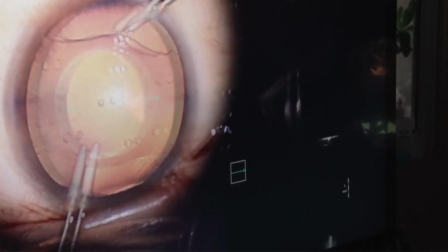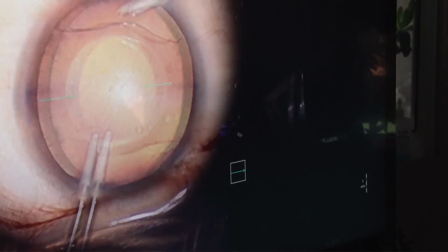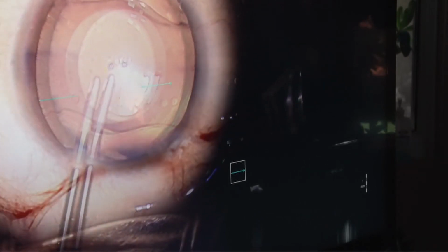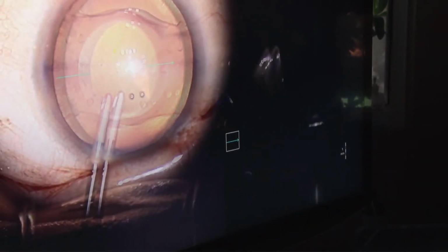I wish the 3D effect was good. You would have seen that I'm under the IPCL. Right. And do you go with the aspiration at the central hole also? Sorry, I used to do that, sir, but nowadays I don't actually do it. I used to go here and let the fluid run over here. As you can see now, the bubble moved. But I've got most of the viscoelastic out now.